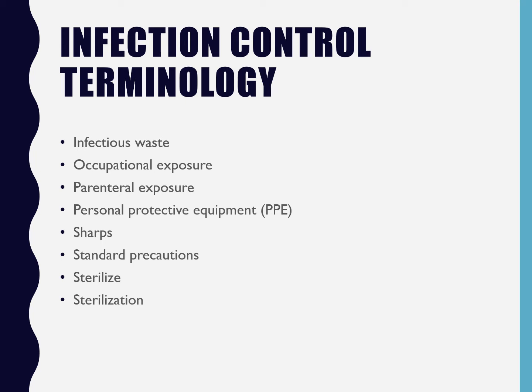So it's personal. It means I'm wearing it. It's protective attire, which includes gloves, mask, eyewear, face shield, gown, things like that. Sharps are any objects that penetrate the skin, including but not limited to needles and scalpels. In dental hygiene, it's every single one of your instruments. Every single one of them will do this, except maybe your mirror, unless you're being really rough.